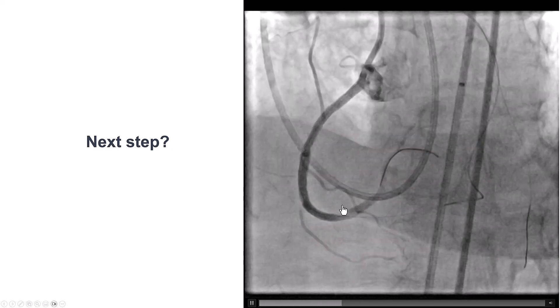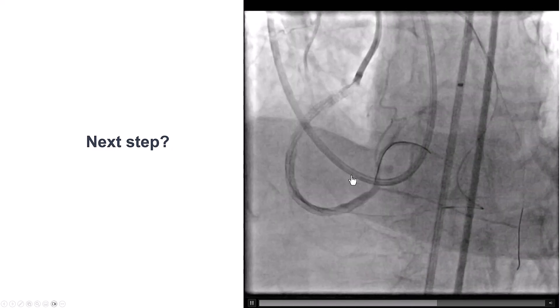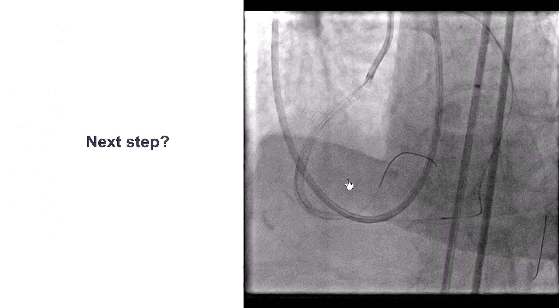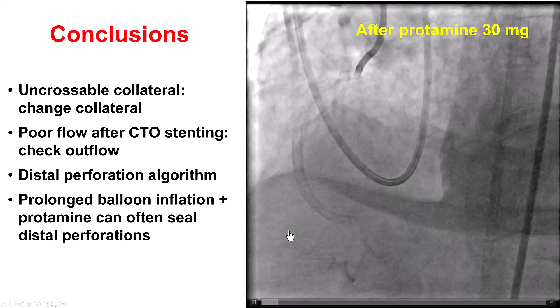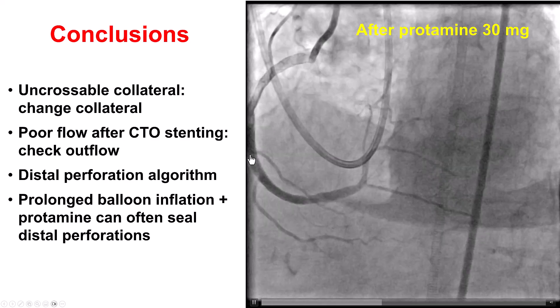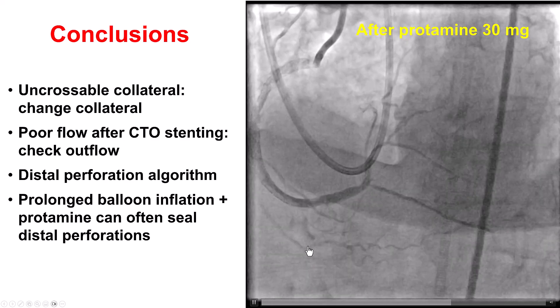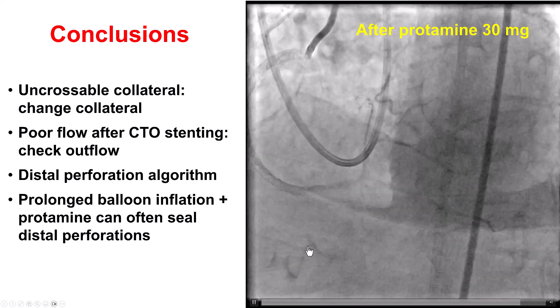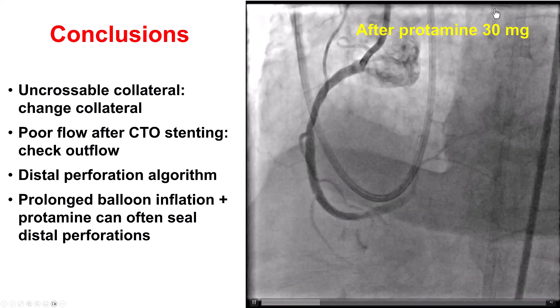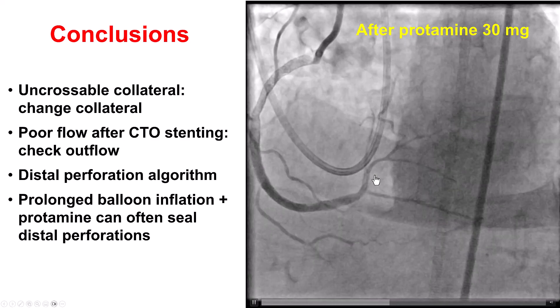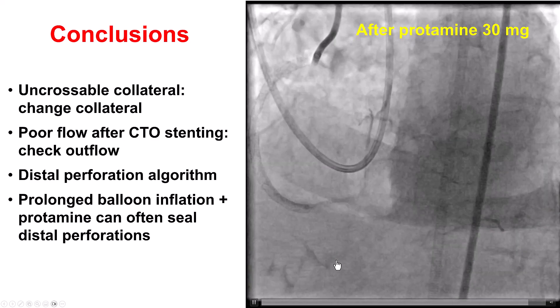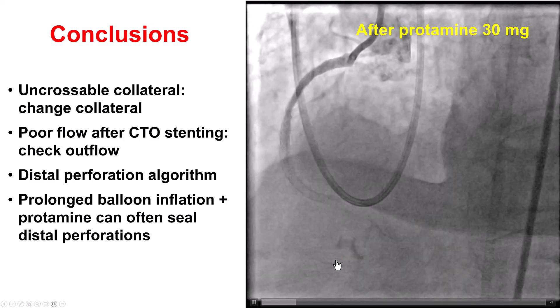We decided to proceed with reversal. To do so, we first removed the equipment from the vessel — the wire and the balloons. We gave 30 milligrams of protamine, and we achieved nice hemostasis without continued extravasation into the vessel.